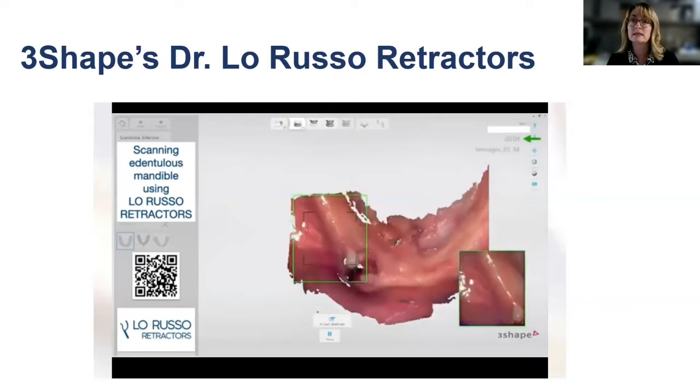And in many cases, you're going to go directly from the scan to the functional try-in and then functional try-in to the finish with 3 to 5 days in between each process. So it could be substantially faster, and is for those doctors that are fully integrating this workflow and they've become masters at it. Any other questions? With the printed dentures too, correct? Yes.